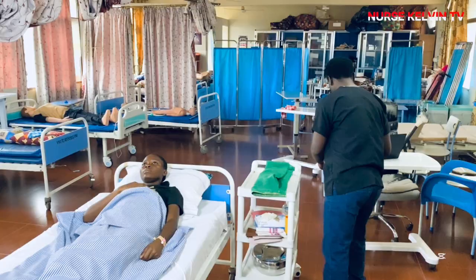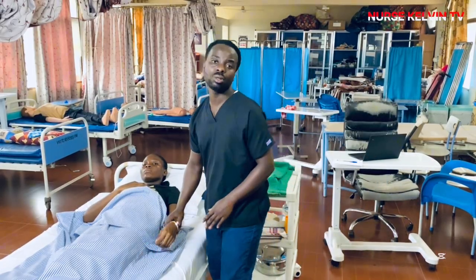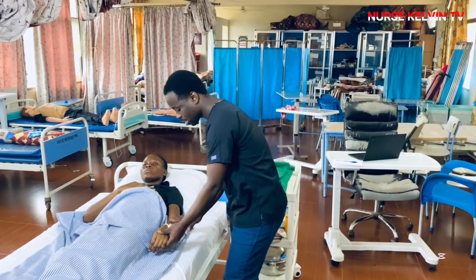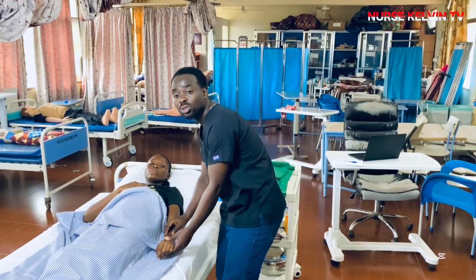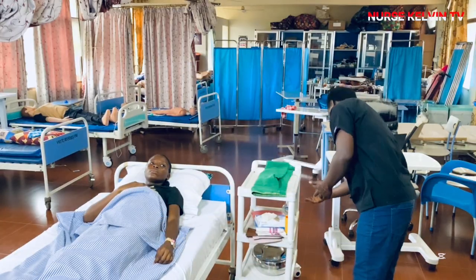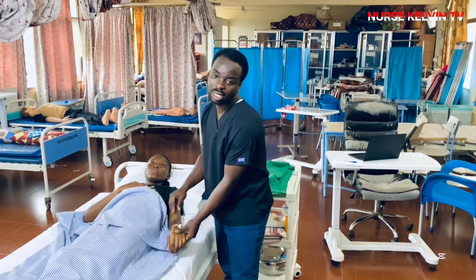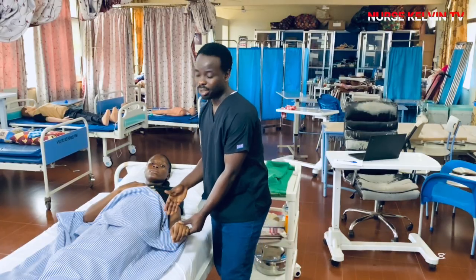So when you are done with the second check, then you assess the site of the cannula, whether you see there is redness or there is infiltration. If there is infiltration, then we have to remove the cannula.